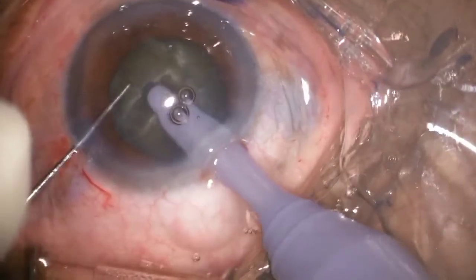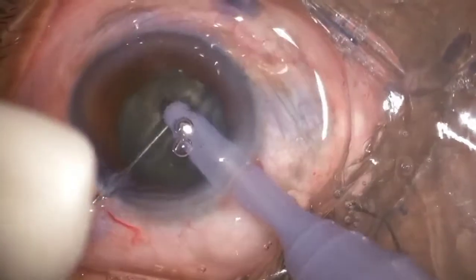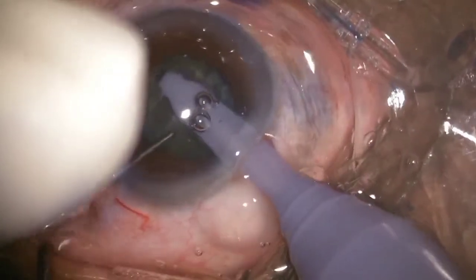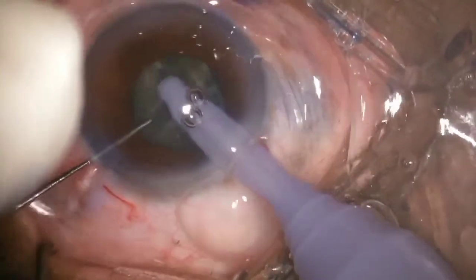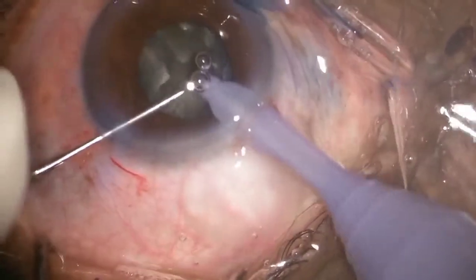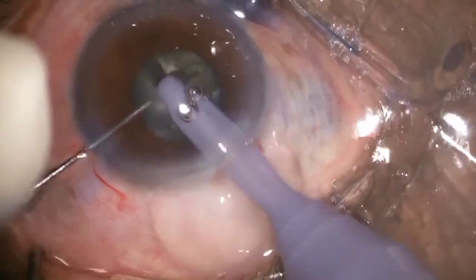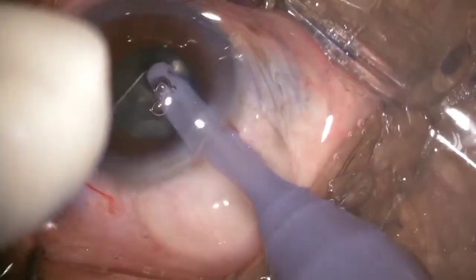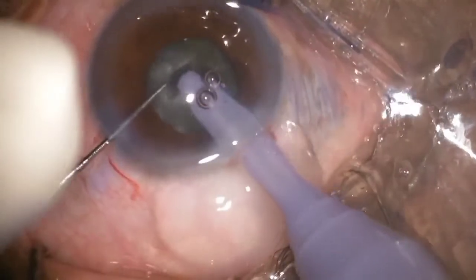The trenching depth was not so deep, and the trenching length was also very small, and I was thinking that it would be enough. The more I was doing the trenching, my foot position was coming to zero, and the pupil became smaller. So when I was doing the trenching on the main side, I thought it's enough trenching, so I can divide it, I can crack it.